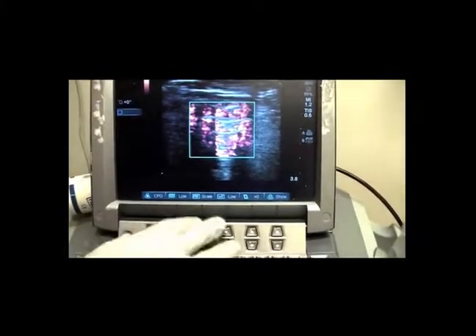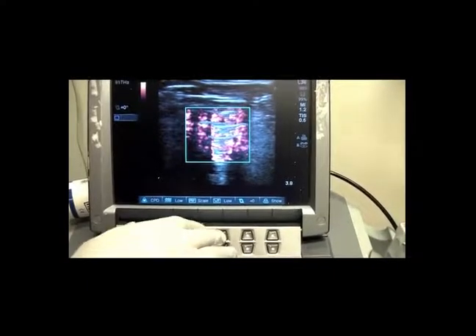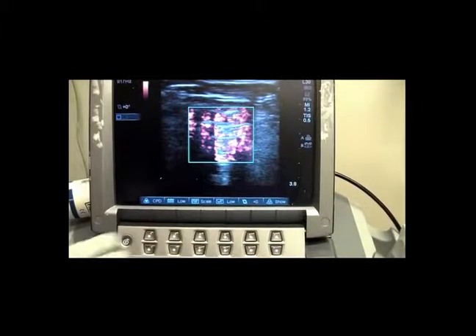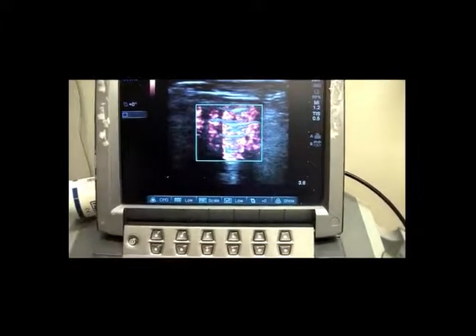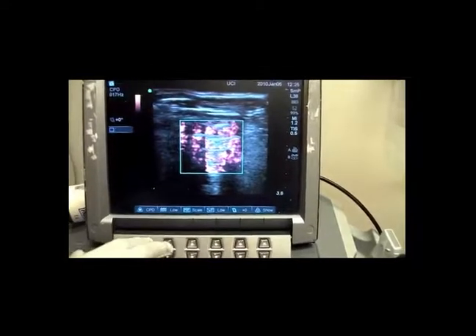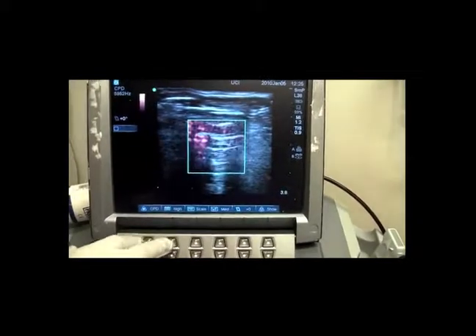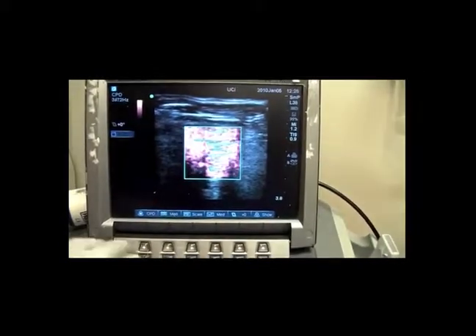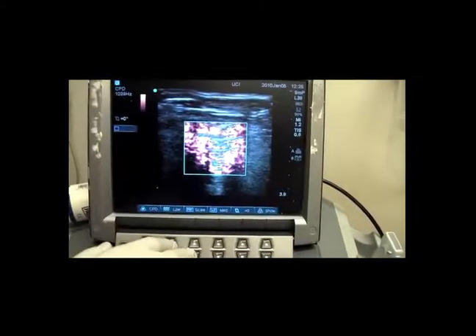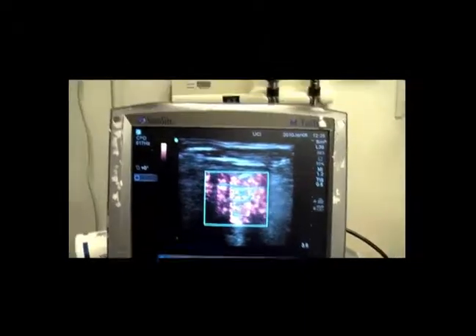You also want to make sure that the wall filter is set to low. If it's not set to low, you can simply use the soft keys to adjust it. This key is a general setting where if you don't have the ability to change the actual frequency, you can change from low, medium, to high — with low being the frequency of choice. You can adjust the scale one more time by pressing scale down to 600 or 800.